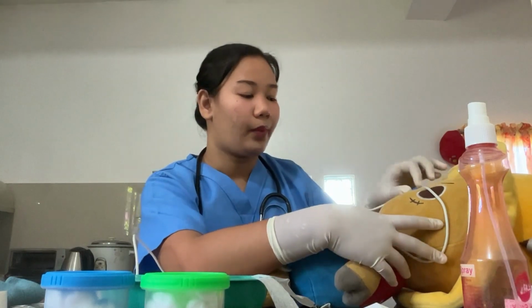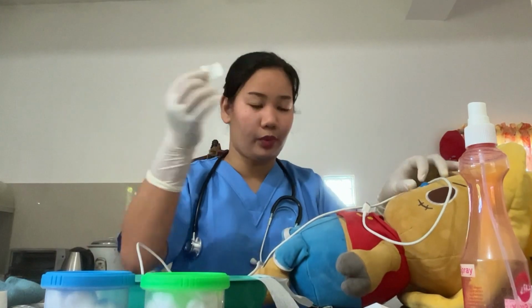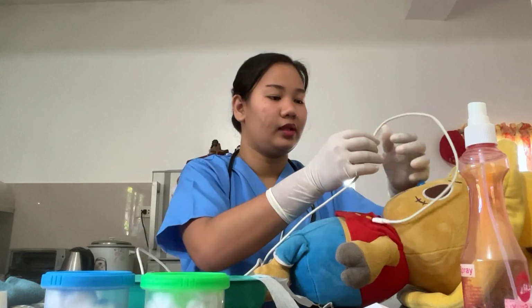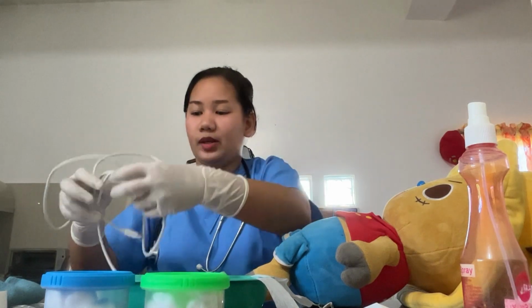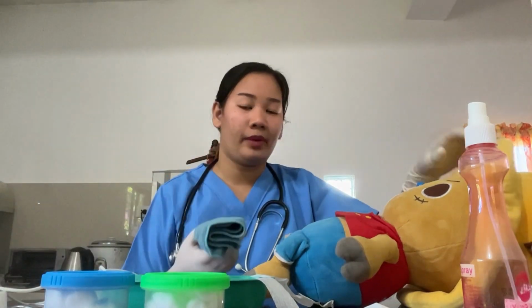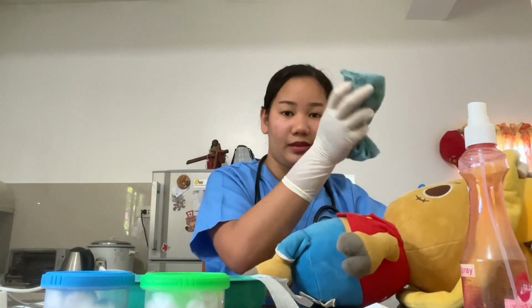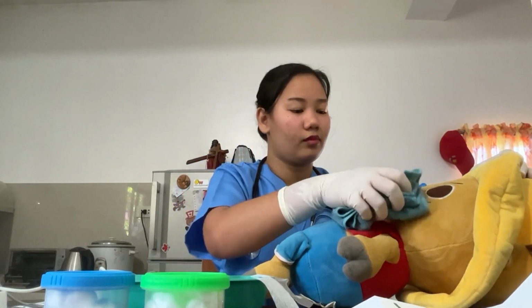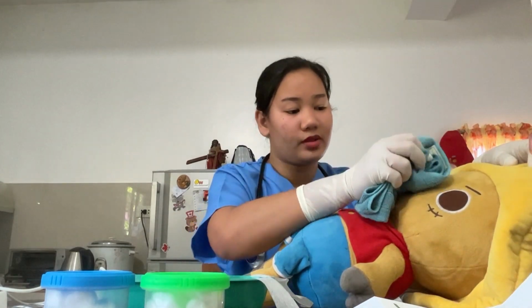Okay, so then I am going to mark this end with a micropore. And then I will set this aside. And now I am going to wipe the patient's face with a clean towel. So I'm going to gently wipe her face, and also her nostril.